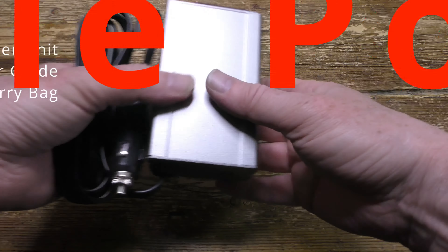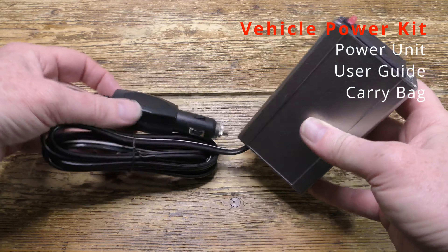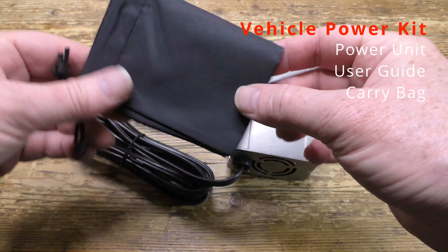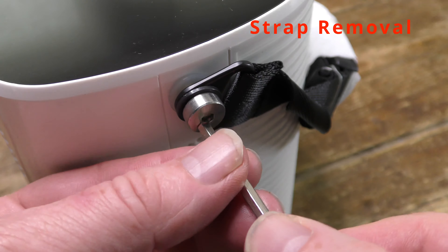A good detailed user guide. Now here's the car power converter with the UK socket and switch on the front, and that plugs into the car's cigarette lighter. And there's the carry bag for it, and again the user guide.